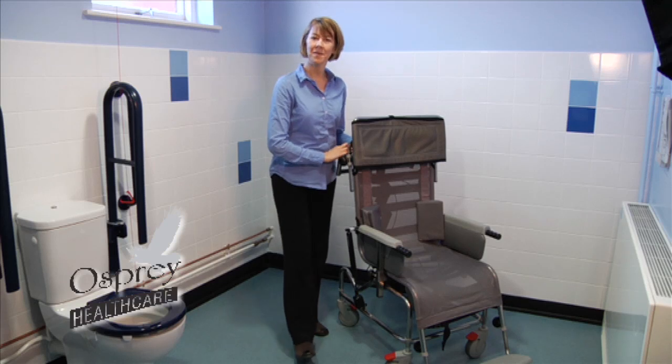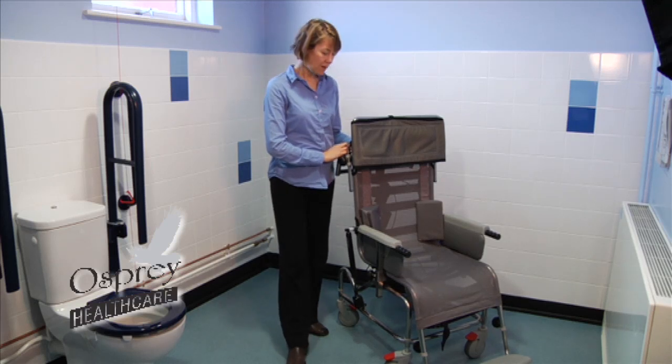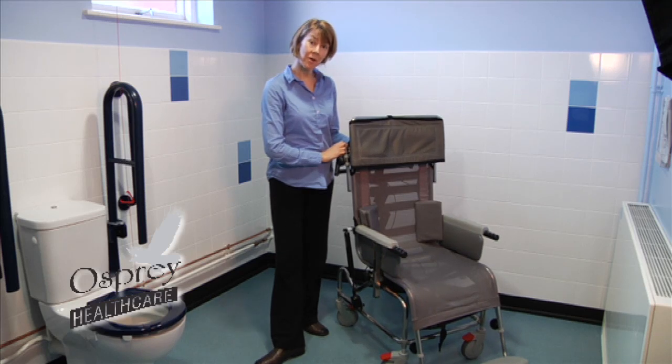Hello, my name's Beth Hallows, and I'm a physiotherapist and a moving and handling trainer and advisor. We're going to have a look together now at the Osprey Healthcare shower cradle.